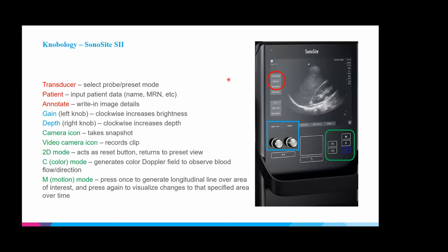So I just wanted to have these two slides coming up. Basically, I wanted to make sure you were all familiar with the ultrasound machines that are most commonly used in our hospital system. Has everyone seen this one? These are the ones that you generally sign out of the intensive care unit, right? These are the stand-up, upright Sonosite machines.